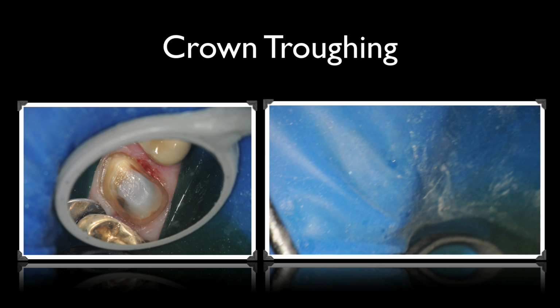You can initiate it in the blood, and you can see there it just initiated a little bit on the mesial, and now I get a much better cut. You leave the tissue, the diodes just straight. There you go. And now you see a little bit of a plume, and you know that you've initiated the tip. You're ready to go.